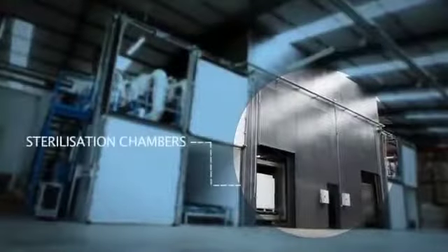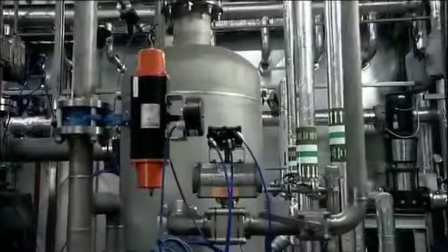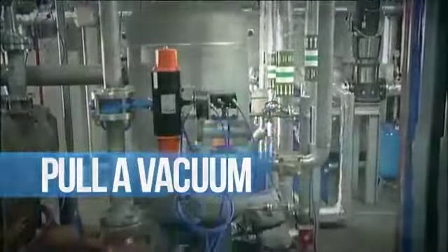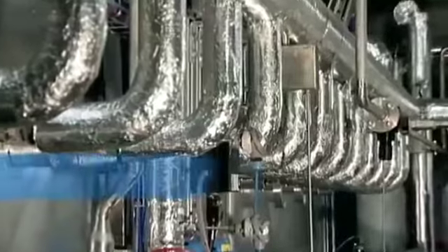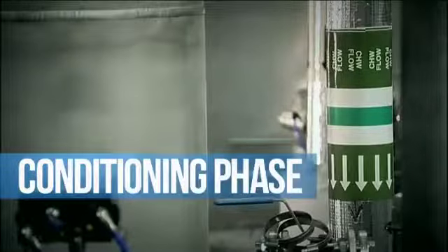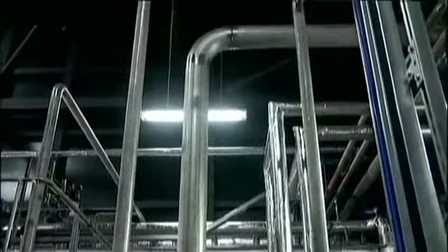There are a number of distinct steps. The first step is to pull a vacuum to remove air from the chamber, followed by a leak rate test to ensure that there are no leaks. For 100% processes, nitrogen is injected and evacuated to reduce the air in the chamber. A conditioning phase takes place to ensure that the load humidity is at optimum levels to optimize the lethality of the ethylene oxide.